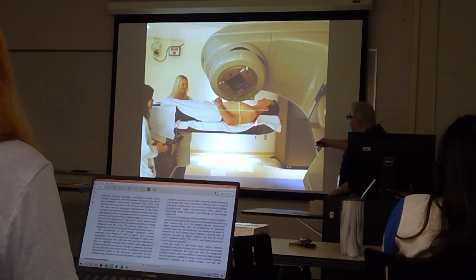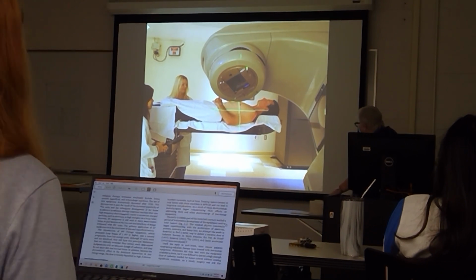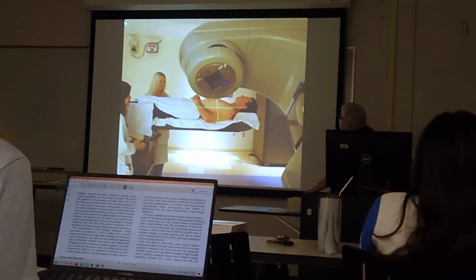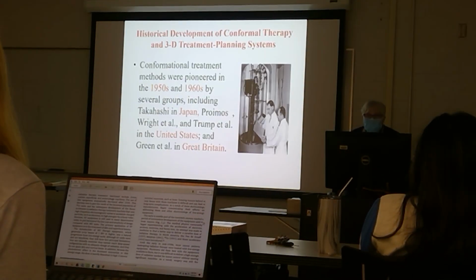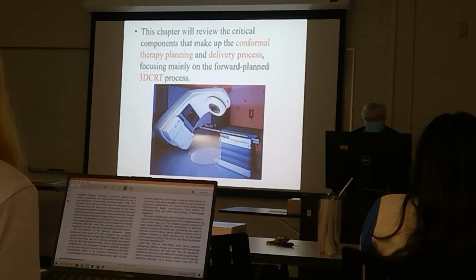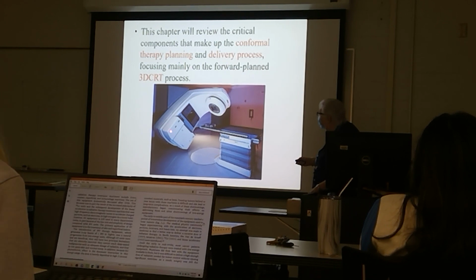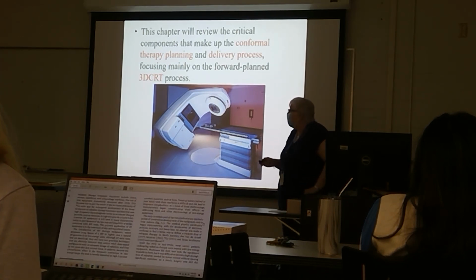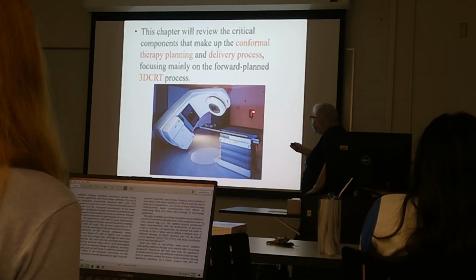But you've got this red thing here too. You see these? This and this? These are back pointers. They put out a laser light that's usually different from the lasers on the wall.